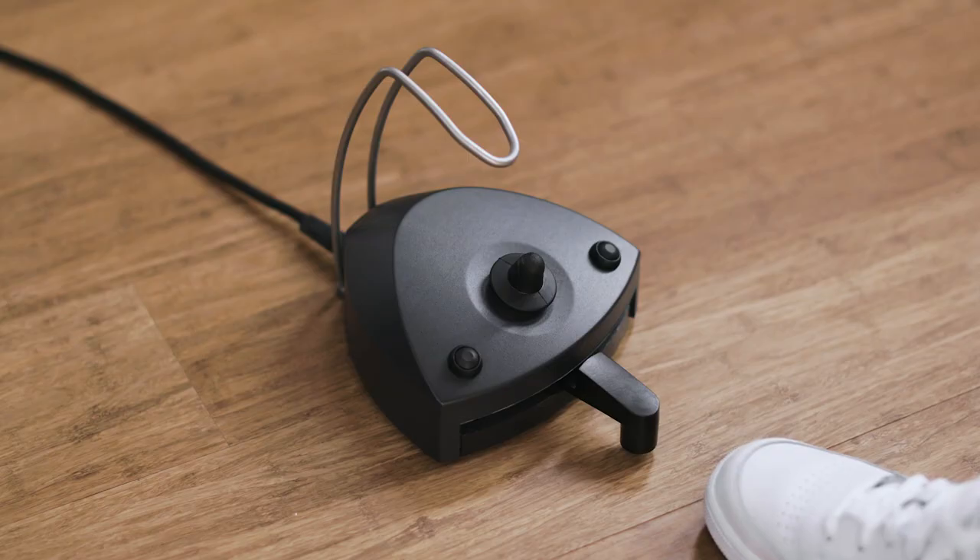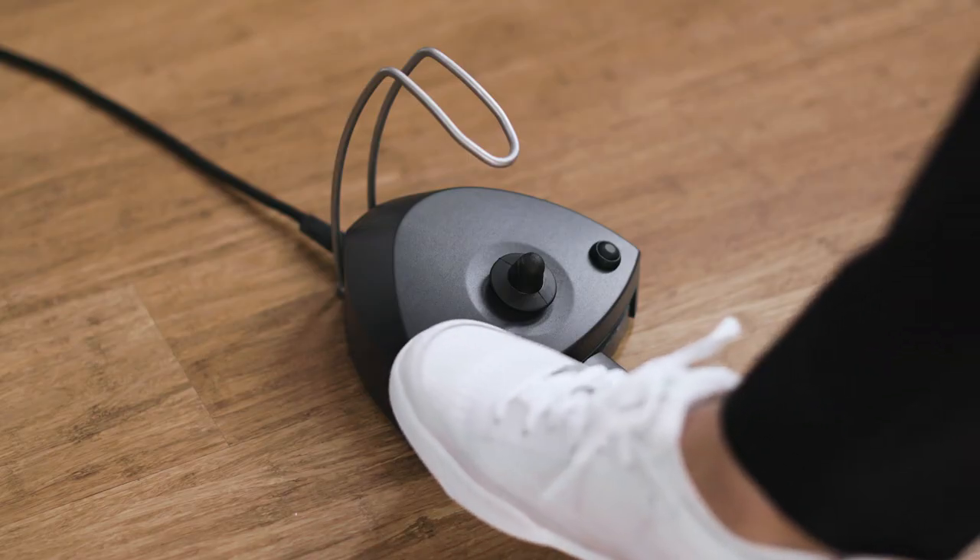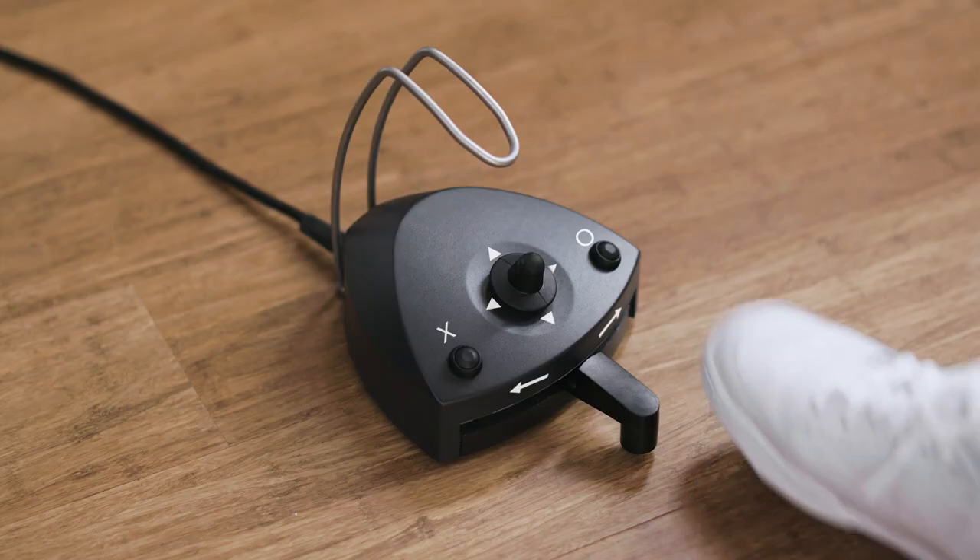Change the spray selection — water and air, air only, or no spray — by tapping on the left button X.